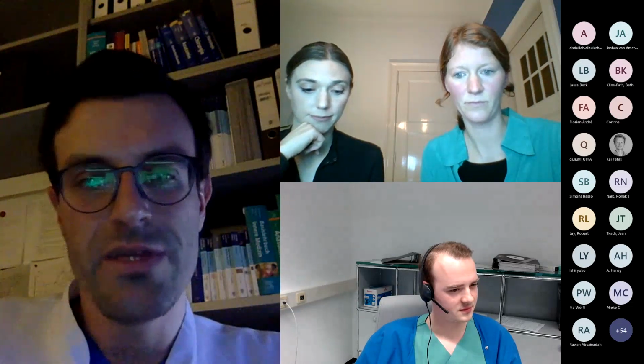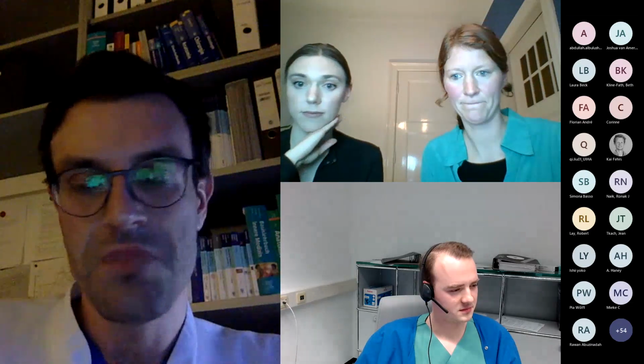Yeah, not too thin image slices. Maybe 1 point. Yeah, it's all. Yeah, the problem is always the breath hold of the mother, because it's only, let's say, for 12 seconds, 30 seconds, but not much more, and then you are limited in modifying your parameters, and so the SNR is limited in some way. That's always a compromise you have to do, and the limitation is definitely maternal breath hold.